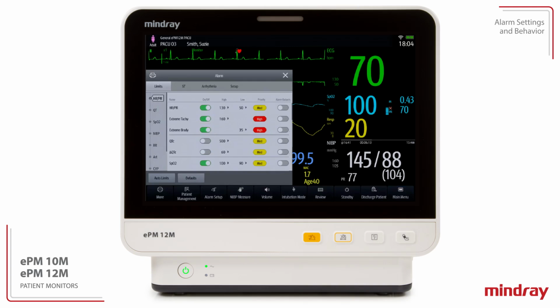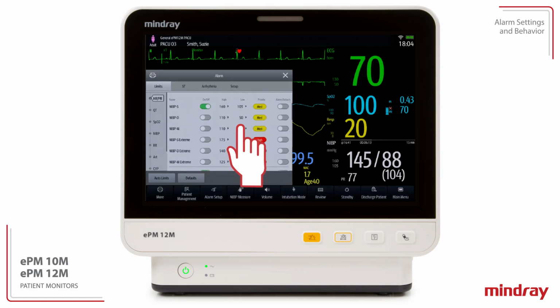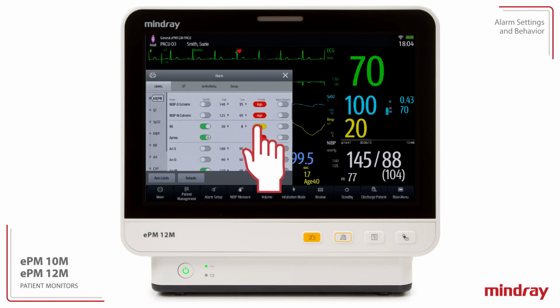To adjust alarm limits, select the numeric value in the High or Low column. Scroll and choose the new limit. Priority levels are based on the parameter. For example, heart rate and pulse rate have priority levels of high or medium only. Respiratory rate has priority levels of high, medium, or low. Select the button in the Priority column to choose a new priority level.